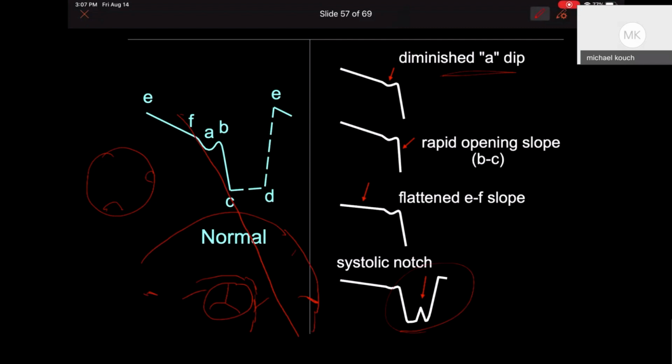So you take the palm of your hand and you move it down to the left of you, and it's going to turn the probe to find all of these structures here, because normally your aortic valve will be right in the middle. And we'll do that in clinical practice. We'll go through that when I work with you guys. We'll go through each probe position, because this is a really important finding.